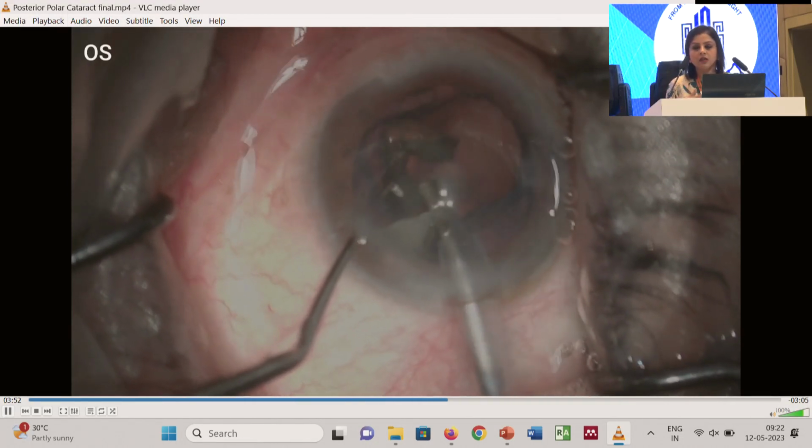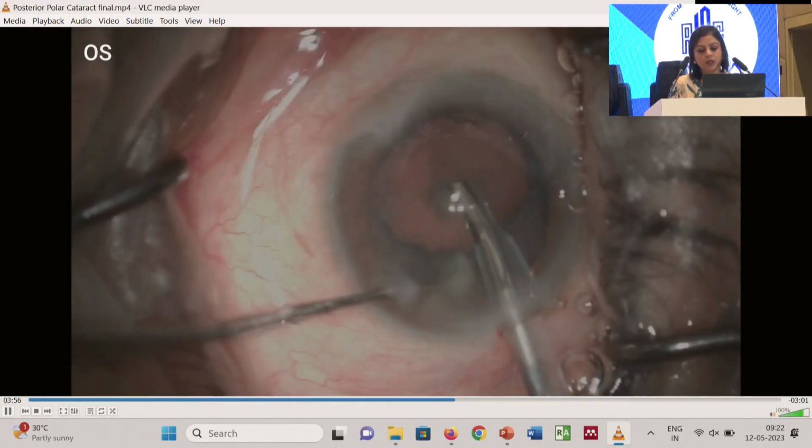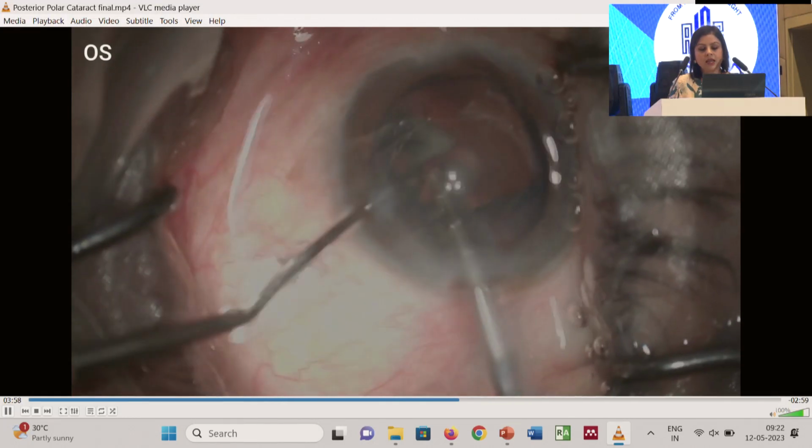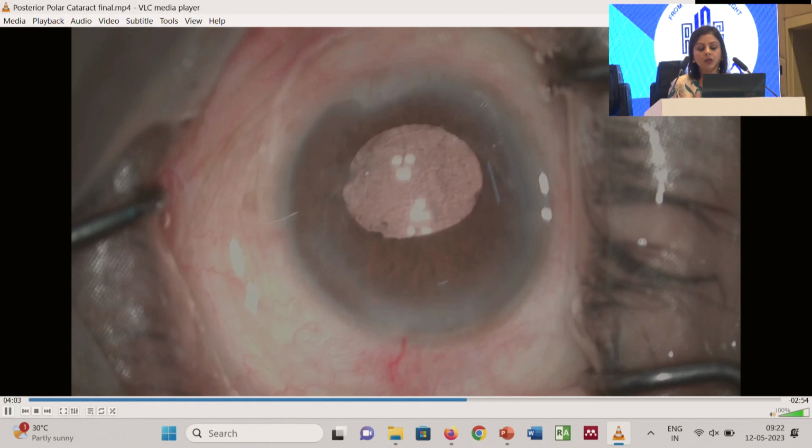I have aspirated significant amounts of anterior epinucleus so that I have better access to the nucleus. And this is the end of our nucleotomy. We follow the same principles and aspirate the epinuclear plate, and this is the end of the case.